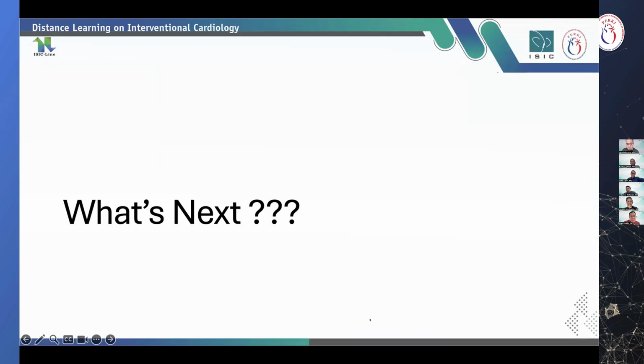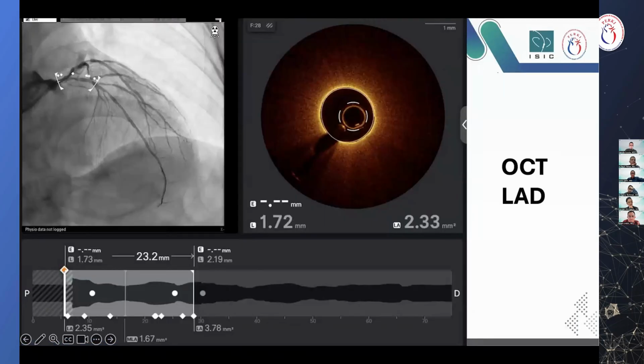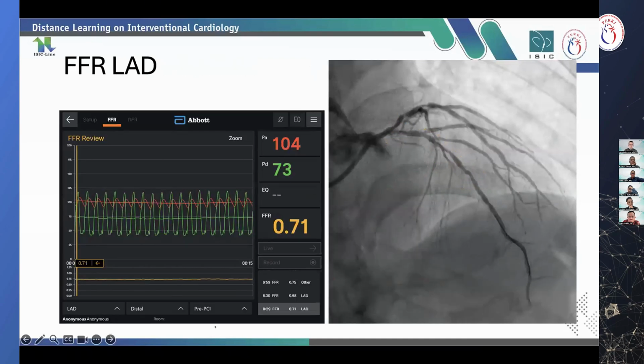Okay, a very good diagnostic. So you are already using the functional test and showing the pressure jump. So what do you think if there is no pressure jump? This is a significance, but no pressure jump. What will you do? Are you asking me or? Yeah. Oh, okay. I am asking you.